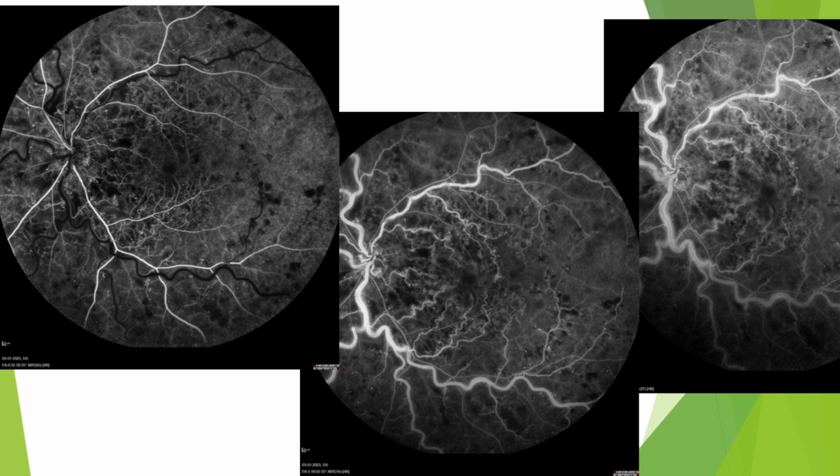In the later phases we can see the tortuous veins and more leakage, and in the late phases we can see the tortuosity and the leakage have increased.